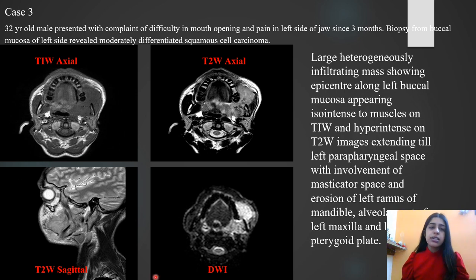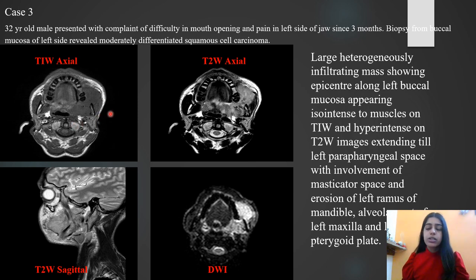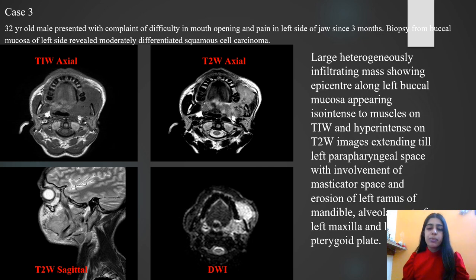In the next case, a 32-year-old male presented with difficulty in opening the mouth and pain in the left side of the jaw for three months. MRI revealed a large heterogeneously infiltrating mass with epicenter along the left buccal mucosa, appearing isointense to tongue muscles on T1-weighted images and hyperintense on T2-weighted images, extending to the left parapharyngeal space with involvement of the masticator space and erosions of the left ramus of the mandible.